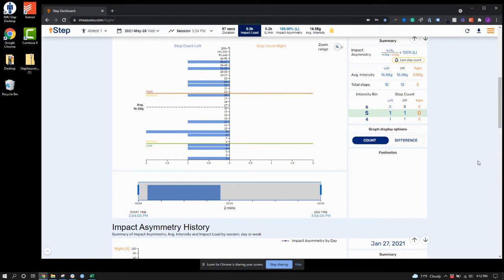Hi there. In this video, I'm going to be taking you through how to upload your bulk export data into a bulk export report that we've created. This will also just show you how to upload the bulk export data into Excel in general.